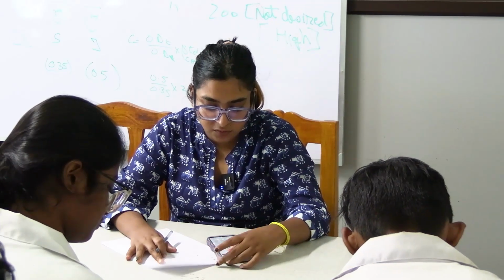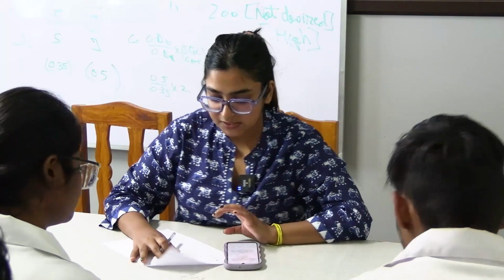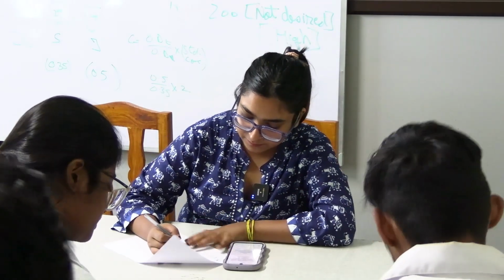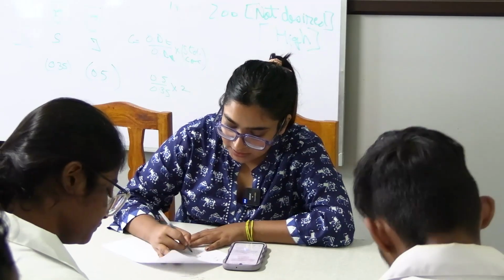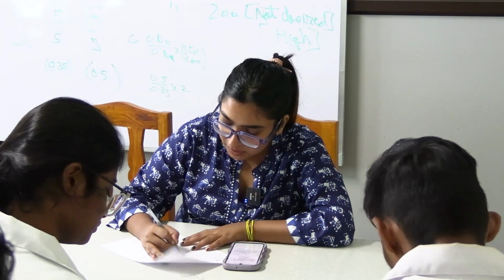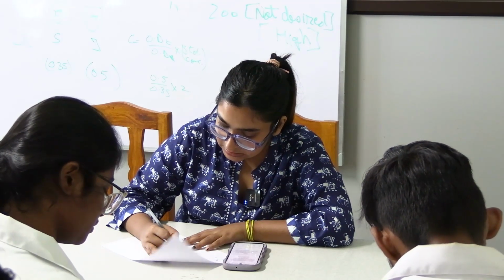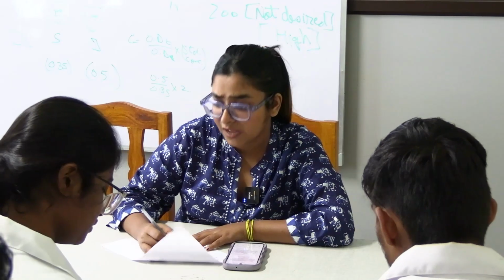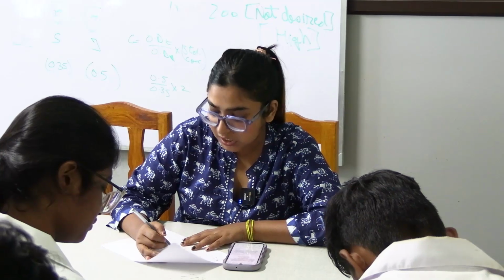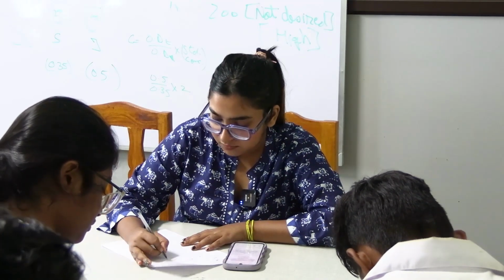Now look at the ABG, all of you. We'll try to diagnose what this person is having from the given ABG. I told you everything basic that you need to know. Now we will jump into the ABG and see if you can solve it. Look at the pH 7.20. Is it more or less? Less. Look at the PCO2 68. More or less? More. Look at the bicarb 31. More or less? The normal bicarb value is 22 to 26, so 31 is definitely more.